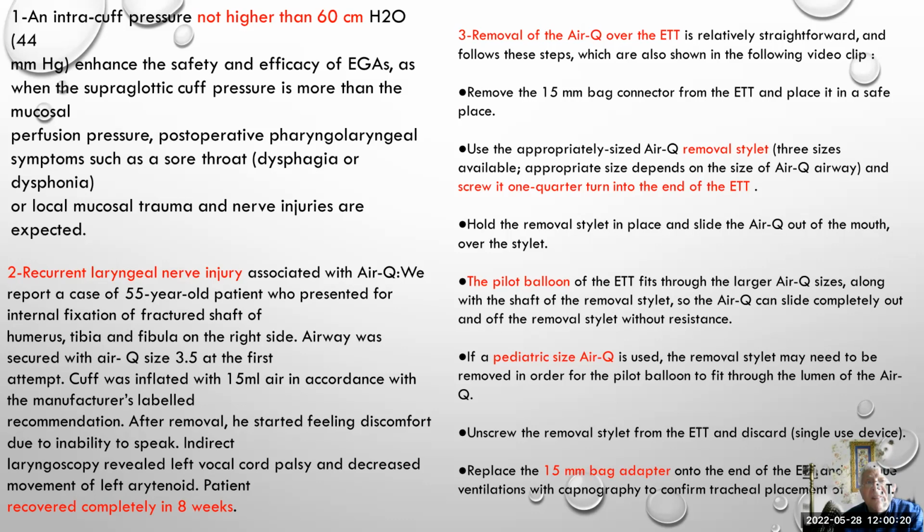There is an interesting article about a famous singer that wanted to do an operation. She wanted to do a cholecystectomy by the scope, and then she insisted to have a device not to use an endotracheal tube. She, of course, is afraid for her voice. So the author used a supraglottic device during the operation to avoid the possibility of injury of the cords.